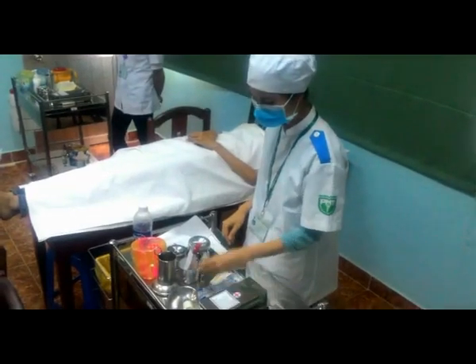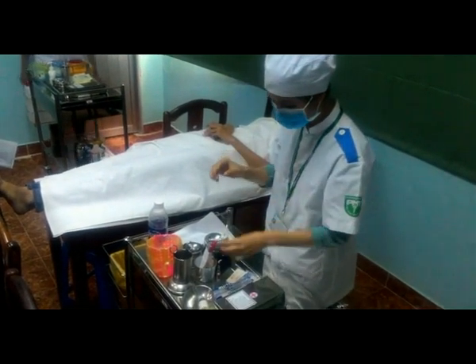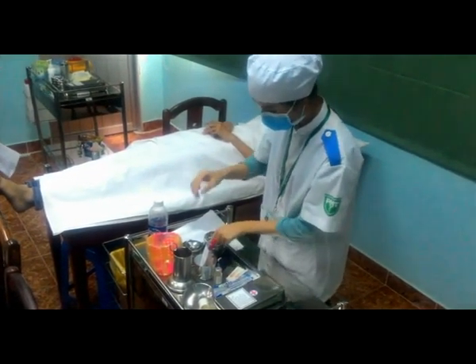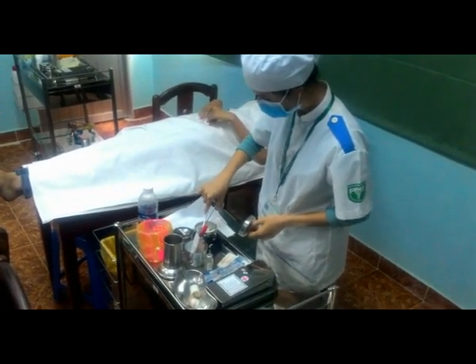Đọc nhãn thuốc, kiểm tra tên thuốc, hàm lượng, hạn sử dụng, đường tiêm và chất lượng thuốc. Mở nắp lộ thuốc, dùng gòn cồn iốt 1 phần ngàn sát khuẩn đầu lọ thuốc.